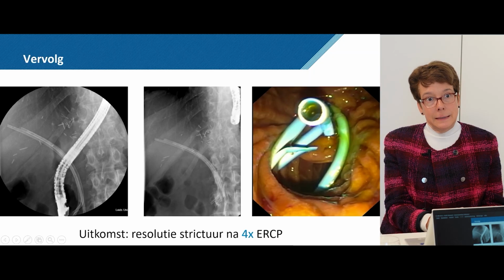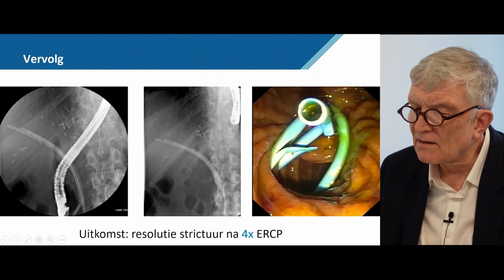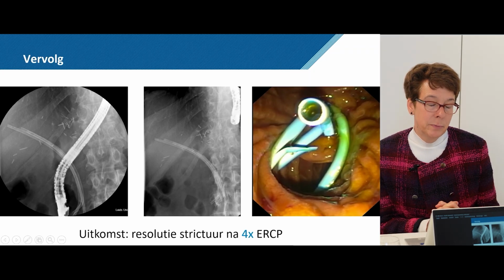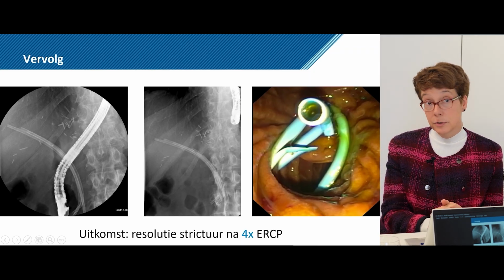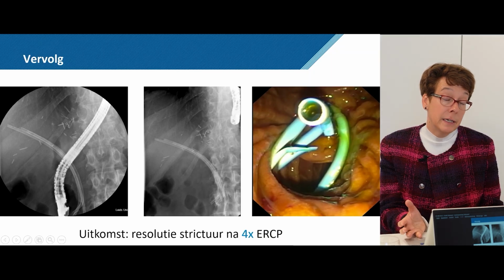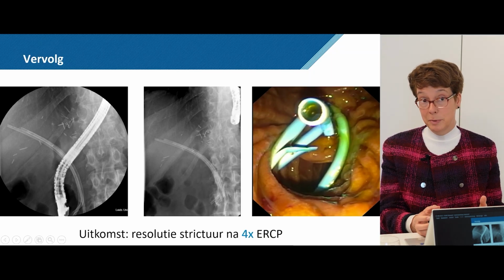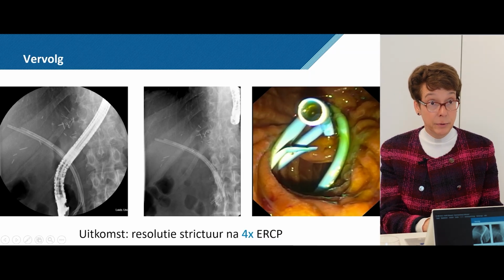That's what our hepatologists tell us. We should rather do a balloon dilatation and place a stent only if it was a very difficult procedure or something special. Yeah, I think that comes especially from the PSC. In the PSC the first treatment would be only dilation. But here it's about remodeling. There's ischemic damage, and most of the patients cannot just be managed with dilation. So we really tend to put in plastic endoprostheses.